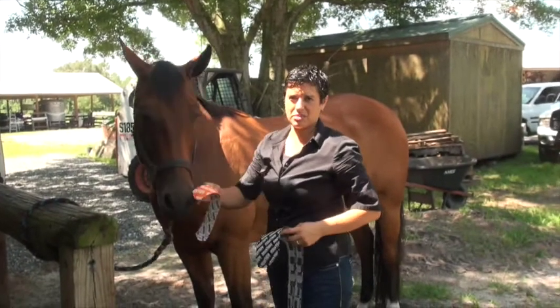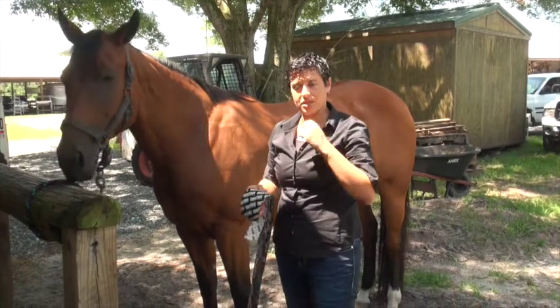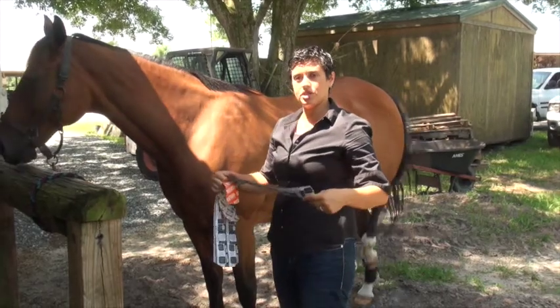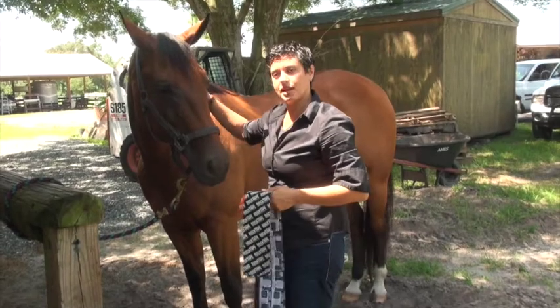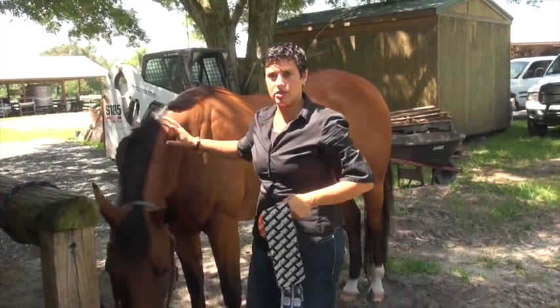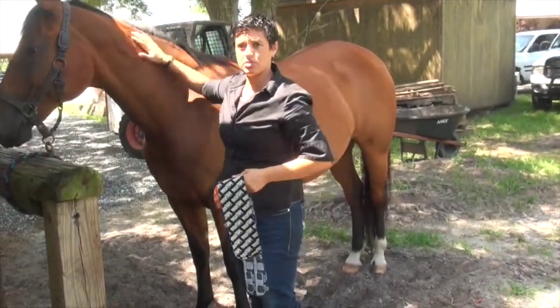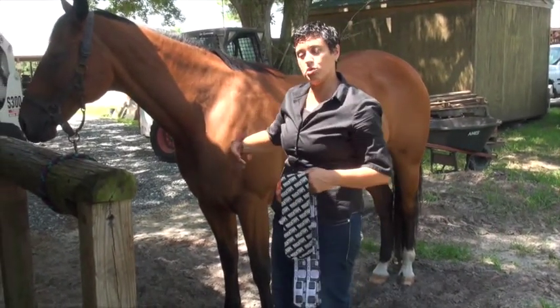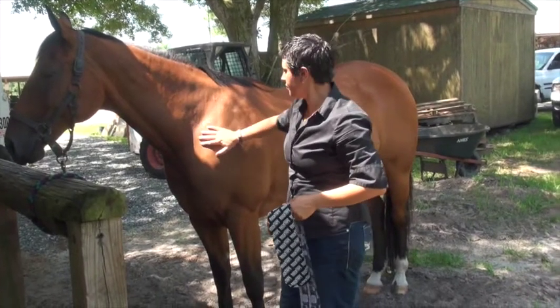Hi, I'm Dr. Angelique Barber, and I want to show you how to use kinesiology tape with horses. Kinesiology tape is a really unique tape in that it stretches when it's applied to the hair on horses, which in turn lifts the skin and has a decompression effect. And what this can do is it can actually decrease pain. We can use it to support muscles and joints. We can use it to decrease inflammation depending on how we cut it. We can also increase proprioception, which helps the animal know where its body parts are while it's moving and exercising and competing, so that helps decrease the risk of injury.